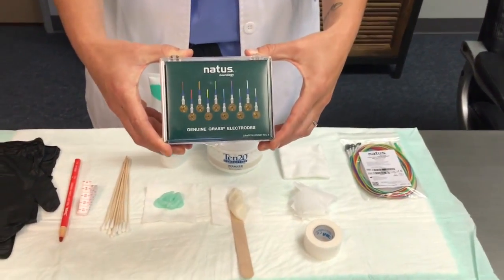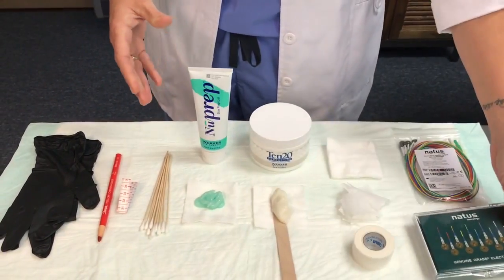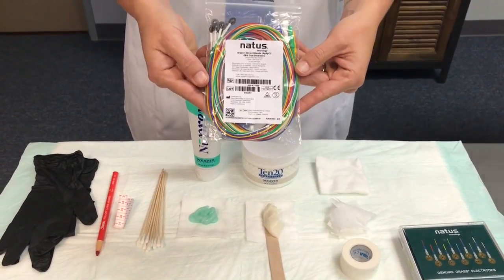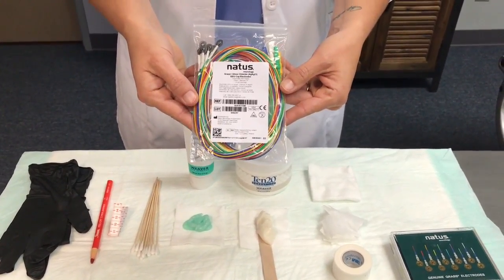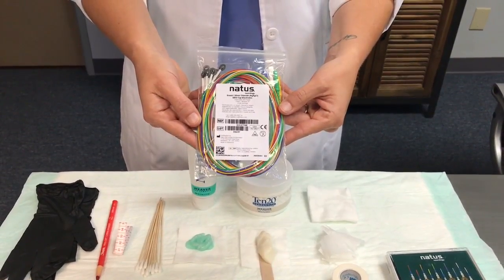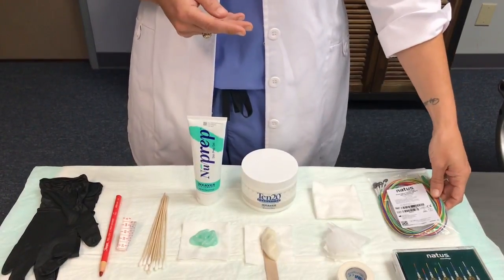High-quality materials, including 24-karat gold-plated and handcrafted electrodes. If you prefer a disposable cup electrode, I recommend the Grass Disposable Deep Cup electrode. These provide peace of mind regarding infection control policy compliance, and they produce quality recordings with both routine EEG and long-term monitoring.